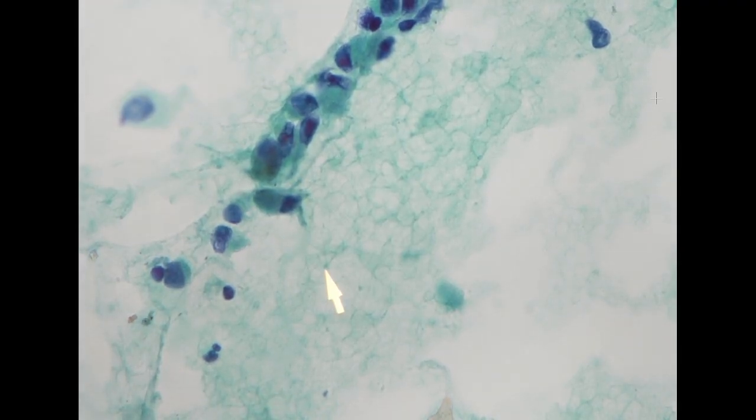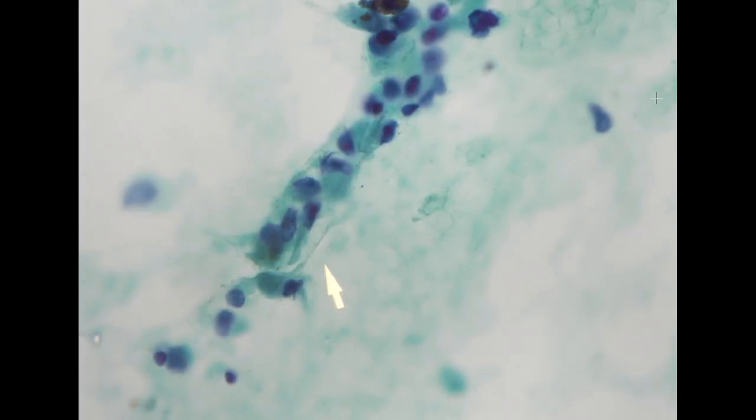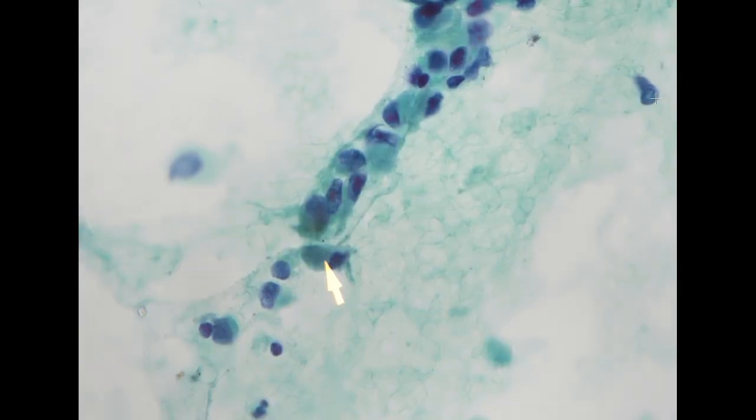And the patient doesn't have a known history, so we will probably wait for the concurrent biopsy to confirm that it is a carcinoma. Just based on the morphology, it is an old male patient, so it will be a little bit difficult to tell. It can be coming from the lung though. So we will wait for the concurrent biopsy to decide if it's a metastatic carcinoma or if it can be some other cancer type.